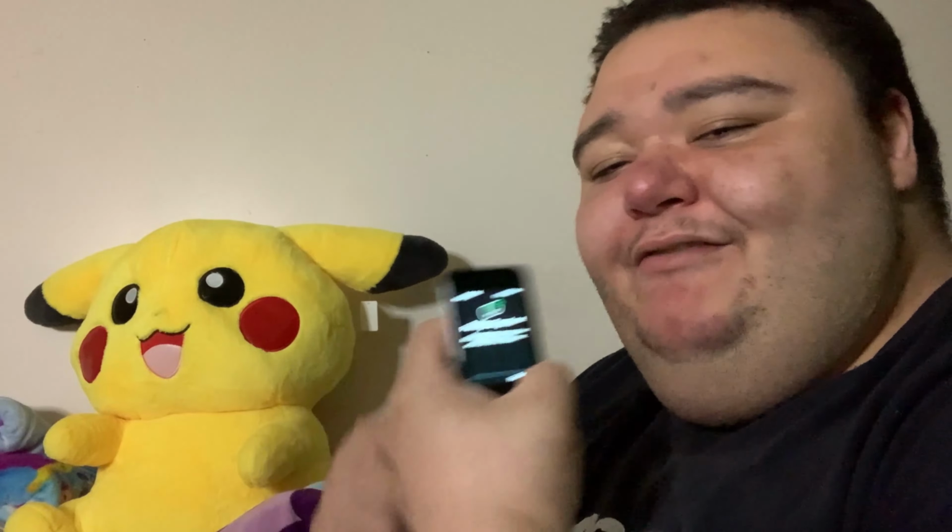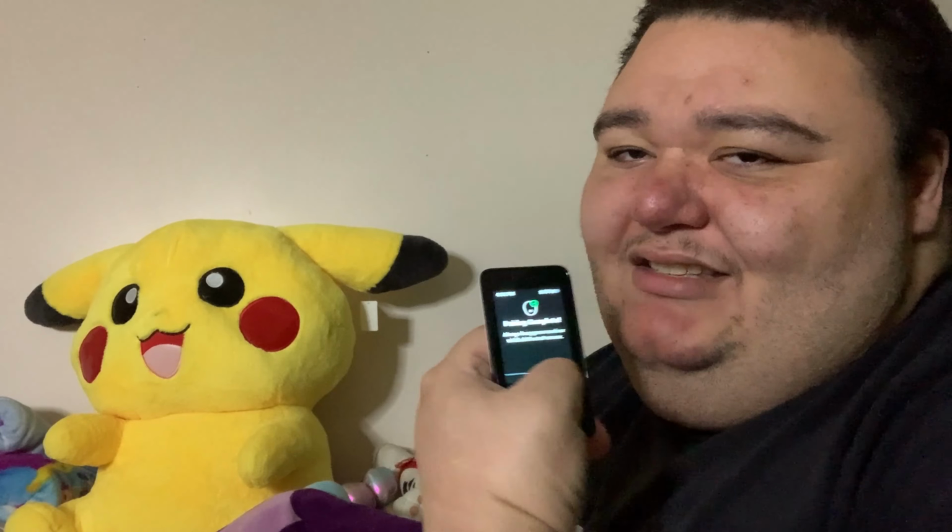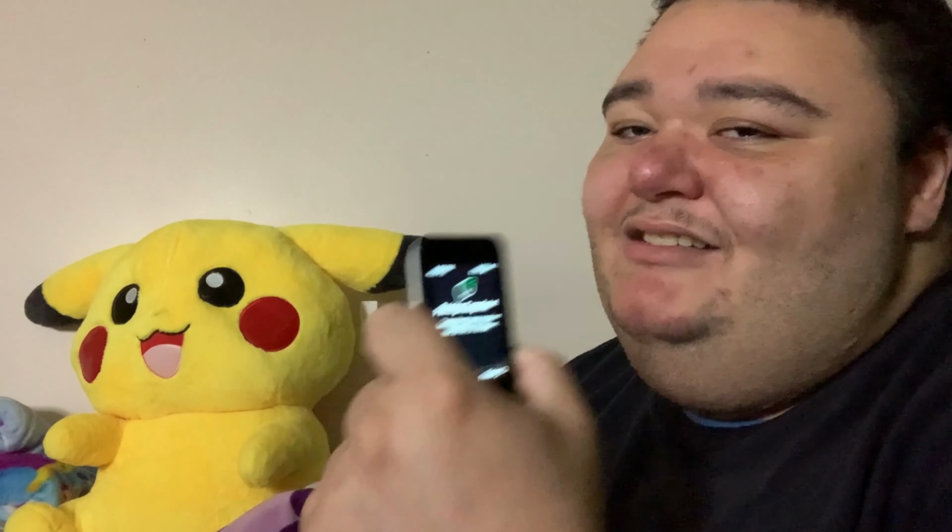Once that's paired to this receiver that Dexcom has for you when you first use the device. This is the receiver part, and of course, Dexcom does this all the time, because once you start a new sensor, they give you the receiver the first time.